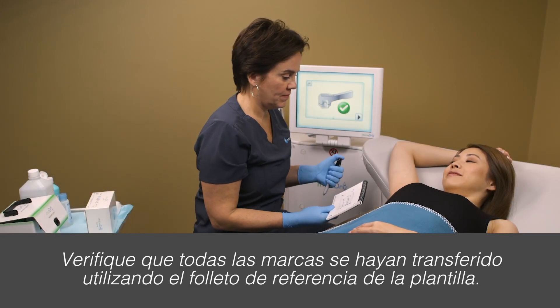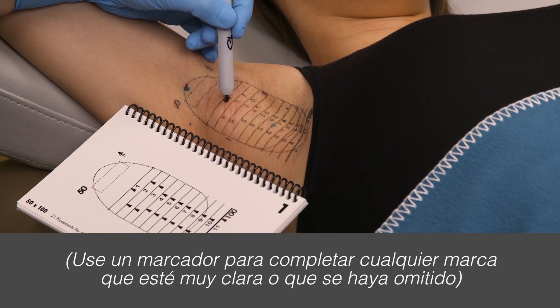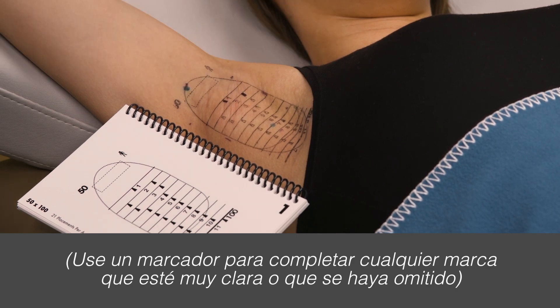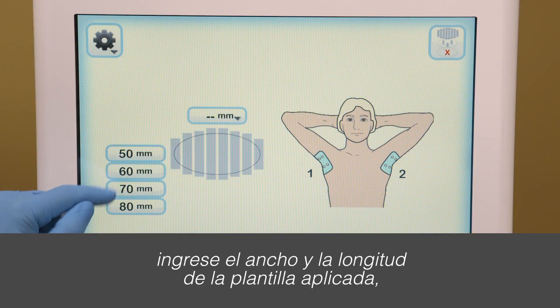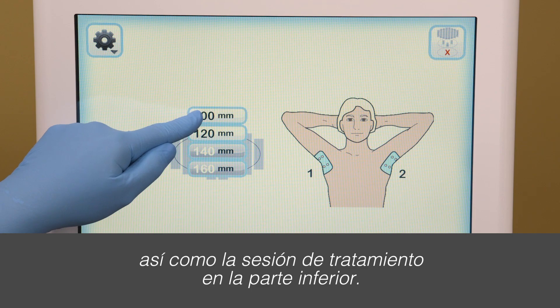Verify all marks have transferred using the template reference booklet. On the touch screen, input the width and length of the applied template, as well as the treatment session at the bottom.